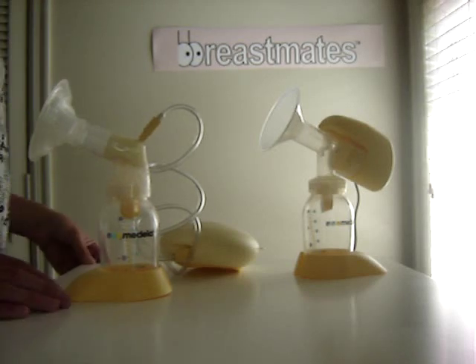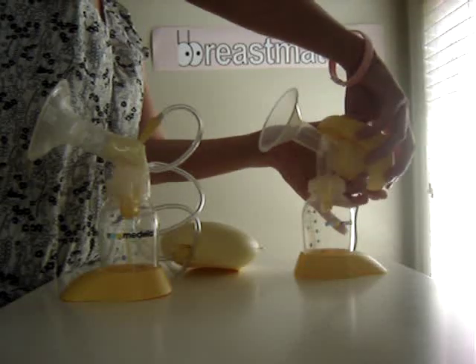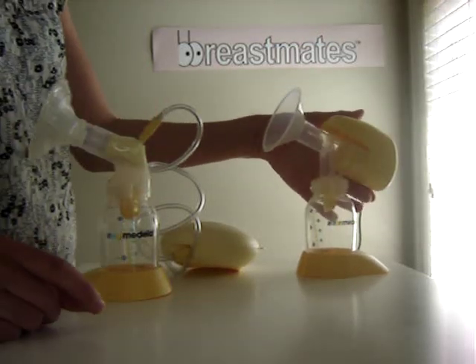I'm just going to do a comparison today of the Medela Mini Electric and the Medela Swing Breast Pump. First up, the Mini Electric. I'll talk over that so you can tell how noisy it is.